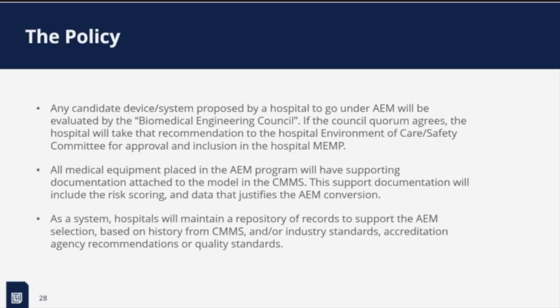Most of the data we used to put this policy together was from all internal data. They didn't want to go outside. Again, different environments, different people doing PMs. Yes, you can use published papers.